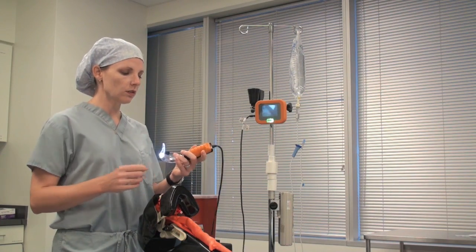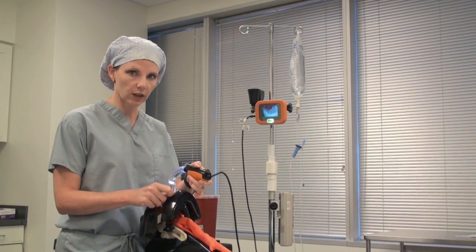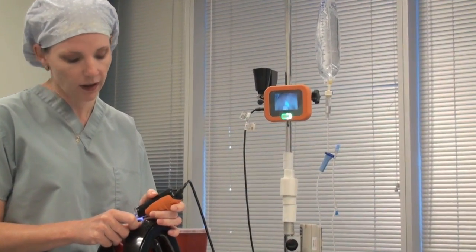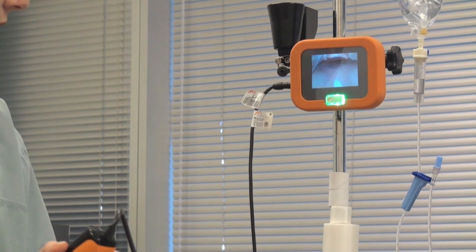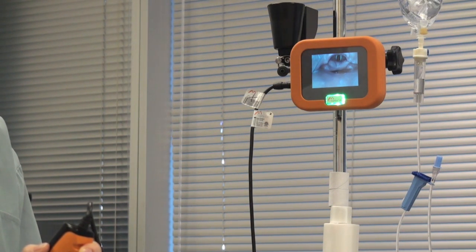Take your Co-Pilot with your disposable sheath on it and place it into the patient's mouth in a midline position, watching the sheath as it goes into the patient's mouth until it disappears into the oral pharynx. Once it safely makes it past the tongue, take a look at your monitor. The tip of the sheath will be going into the vallecula, and then using a rotation movement with your wrist, you'll be able to get a good view of the vocal cords.